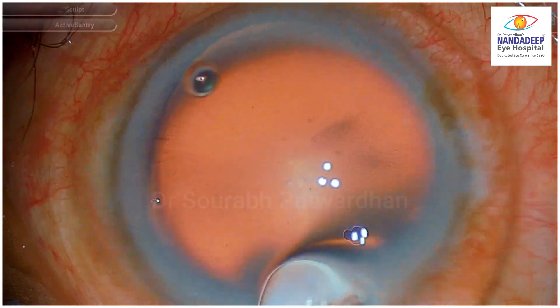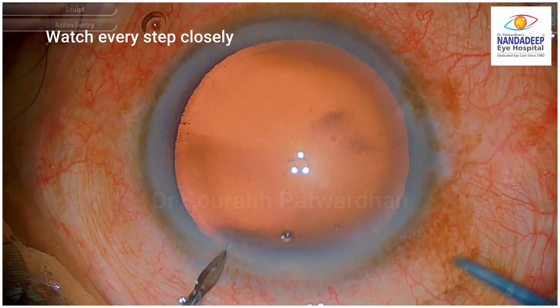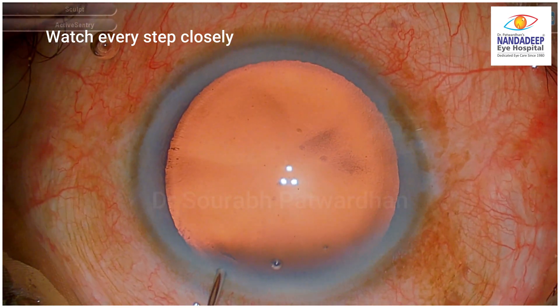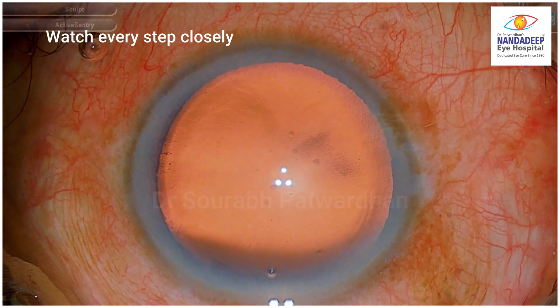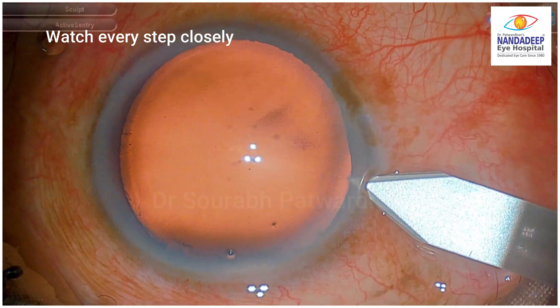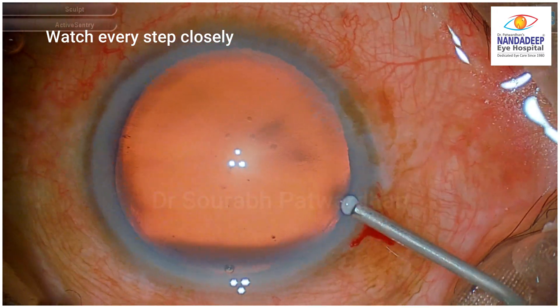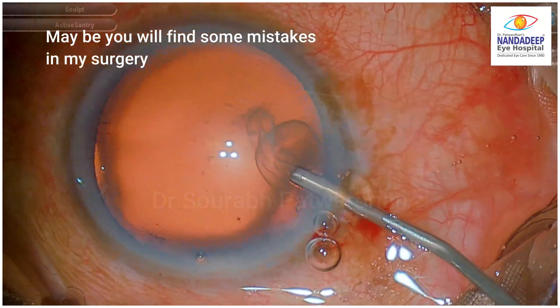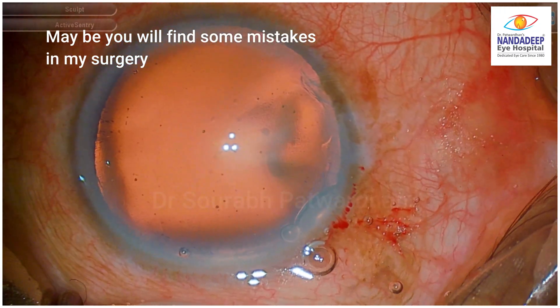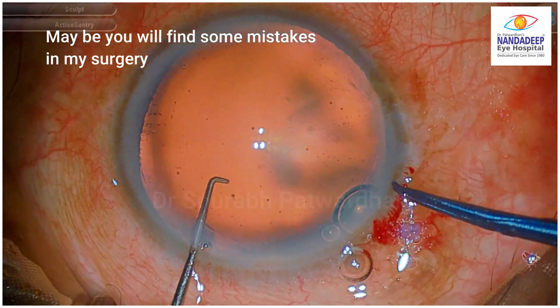I want you to see this case right from the beginning and watch every step very closely. When we watch our routine cases and review those surgical maneuvers, we might get more tips on how to make it better next time. Do find if any of the maneuvers caused this zonular weakness or was it pre-existing — you will come to know when you see the case completely. Do write your comments and tips on improving this surgical case as well.